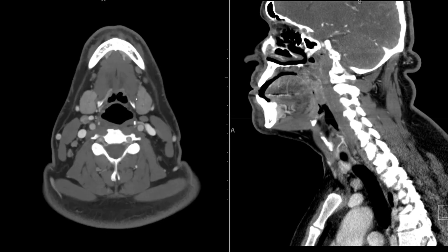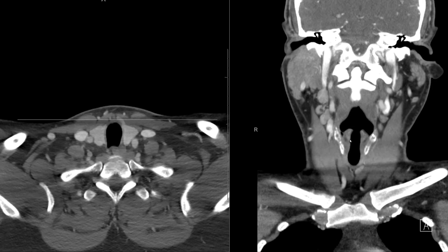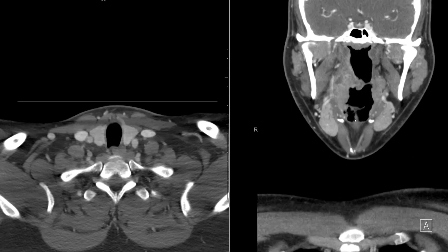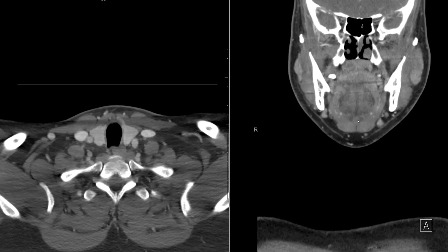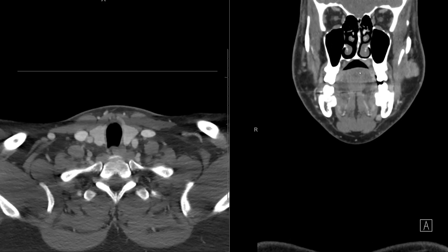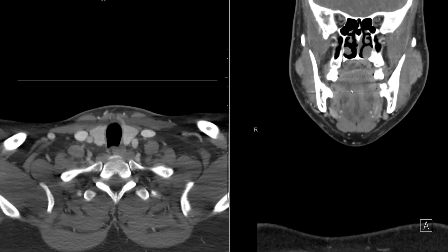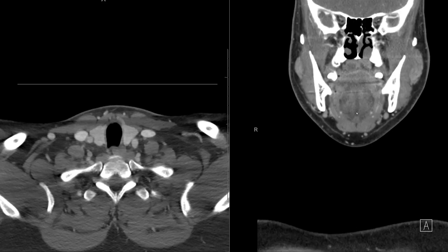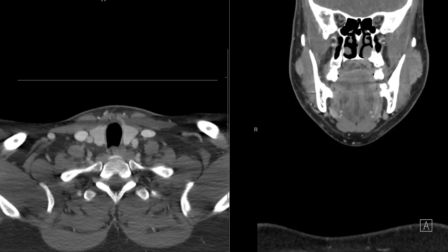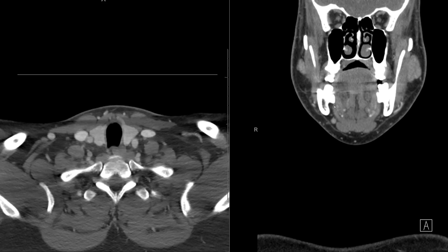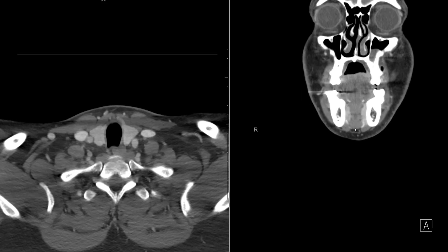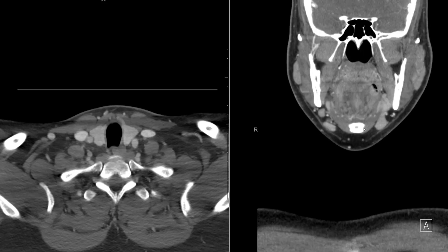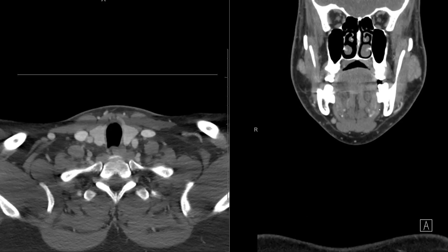We talked about the mylohyoid before, but let's look at it on the coronal view because it's an important muscle. It forms the sling — basically the inferior extent of the floor of the mouth. On the coronal view, we have the patient's tongue and the root of the tongue in the sublingual space. The mylohyoid runs from the mylohyoid ridge inferiorly, attaching to the hyoid bone here, and then continuing back up to the mylohyoid ridge. That is the mylohyoid muscle.